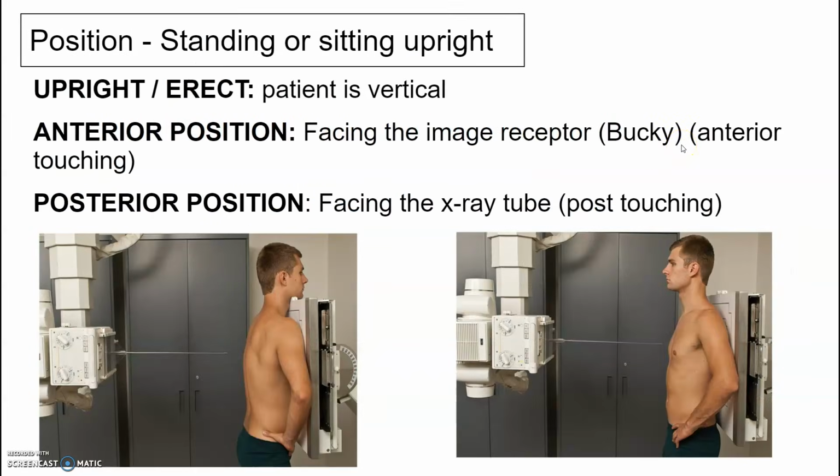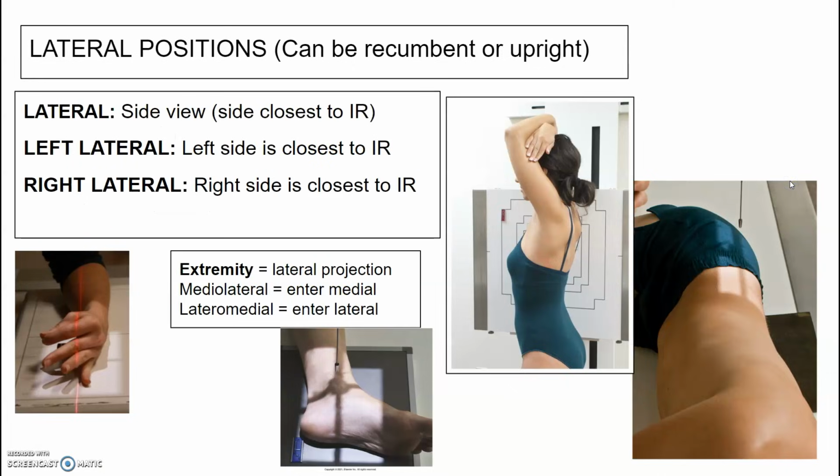Standing up, these are pretty easy, upright or erect. Your patient is vertical. An anterior position means the anterior is touching the board, and a posterior position, posterior against the board. Do not confuse these with projection. Those are different terms. Lateral position. So lateral can be recumbent or it can be upright. The lateral is named by the side closest to the image receptor for position.